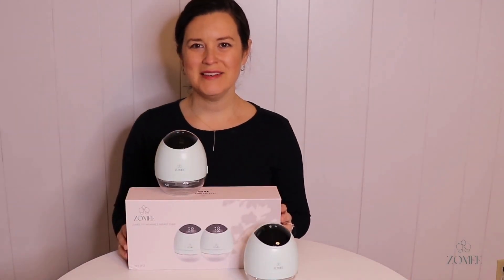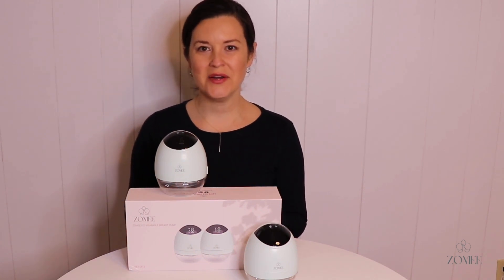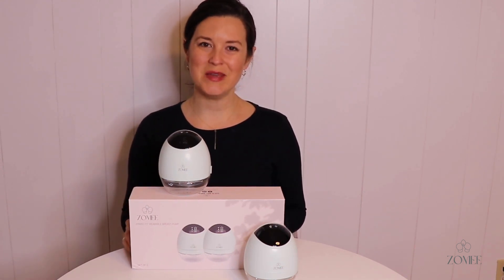Hi guys, it's Cassie Reyes, IBCLC, working with Zomi to bring you videos about pumping and lactation. In today's video we are going to go over some of the features of the new pump that Zomi just released, the Zomi Fit, which is a completely wearable pump.